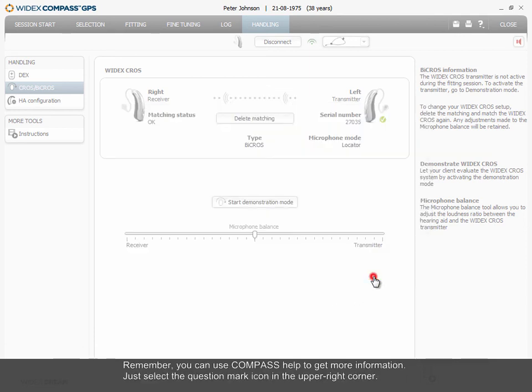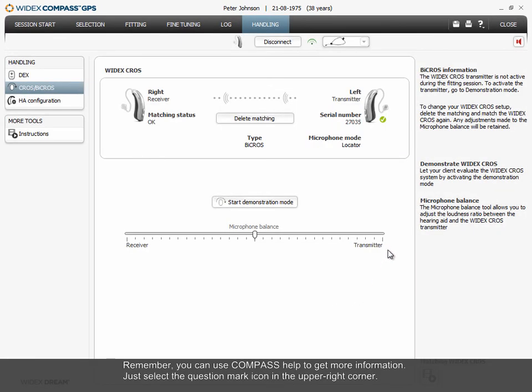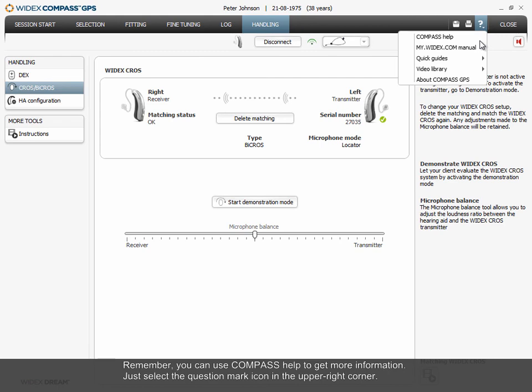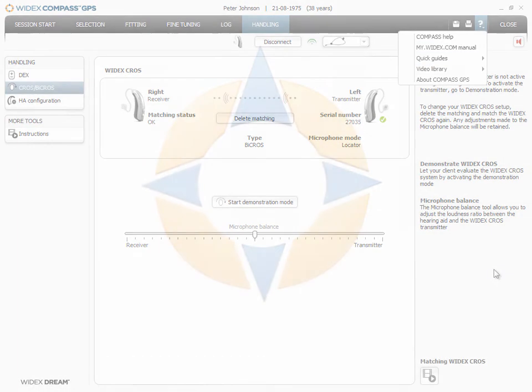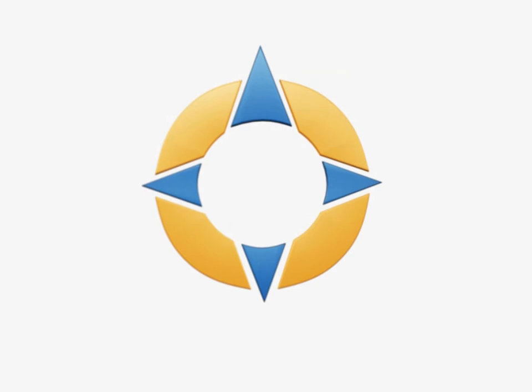Remember, you can use Compass Help to get more information. Just select the question mark icon in the upper right corner. Thank you for your attention.